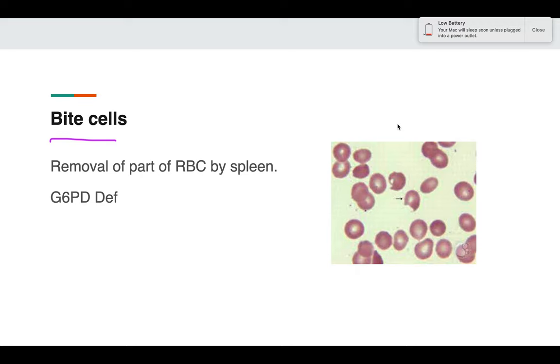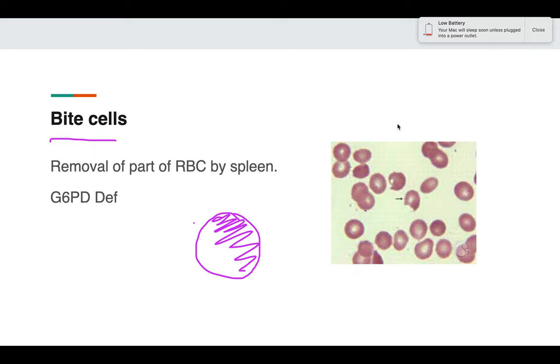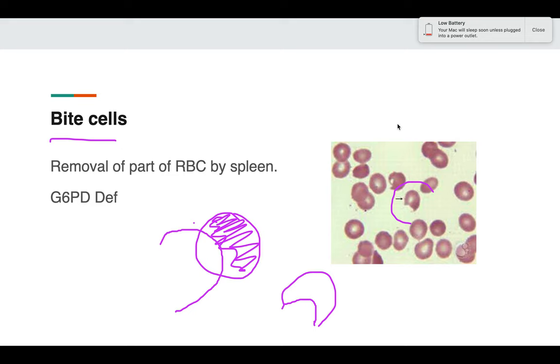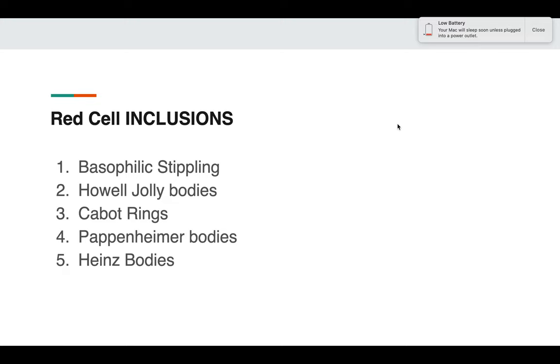Bite cells are also seen in G6PD deficiency. When the deformed RBCs from G6PD deficiency go into the spleen, the splenic macrophages take a bite of it — so a small portion of the cytoplasm is removed by the splenic macrophages. This is how a bite cell appears, and it is characteristic of G6PD deficiency.